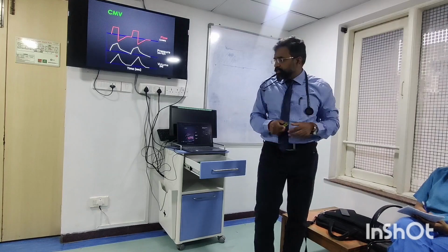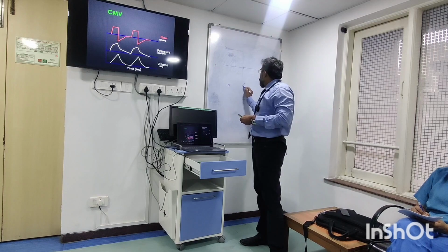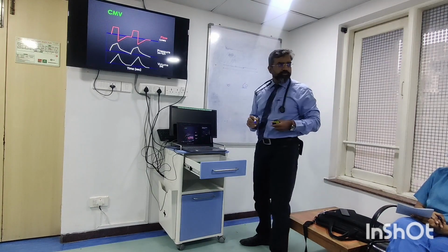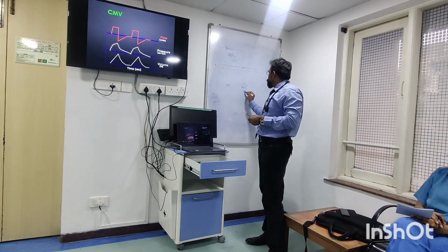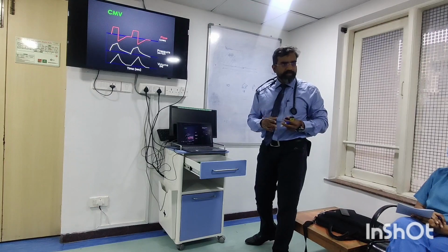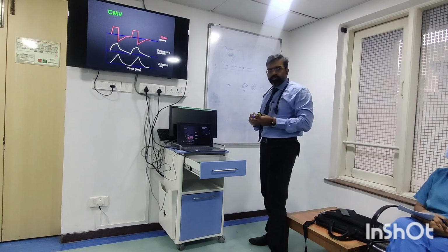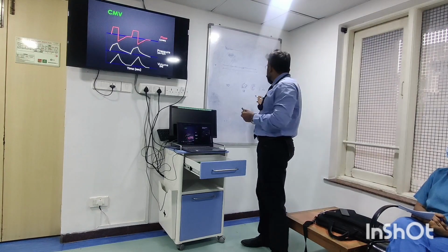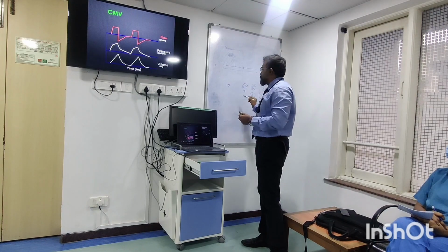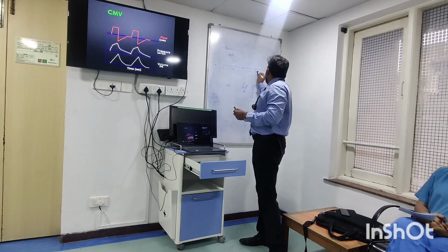That means I set a respiratory rate of 10 in a 60 second breath window. I am saying give 10 breaths. That means every 6 seconds is the breath cycle. In that 6 seconds of breath cycle, I have decided to keep an I:E ratio of 1:2. So if I have a 6 second breath cycle, 1:2 means 2 seconds will be inspiration and 4 seconds will be expiration. So let me put this over here. So you have 2 seconds in inspiration and 4 seconds of expiration.